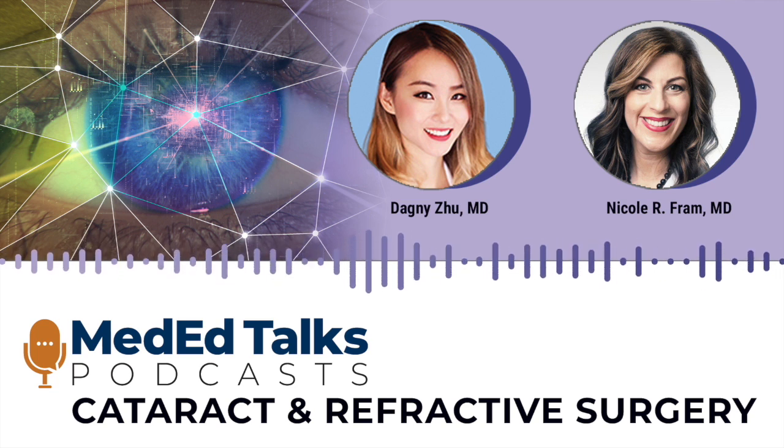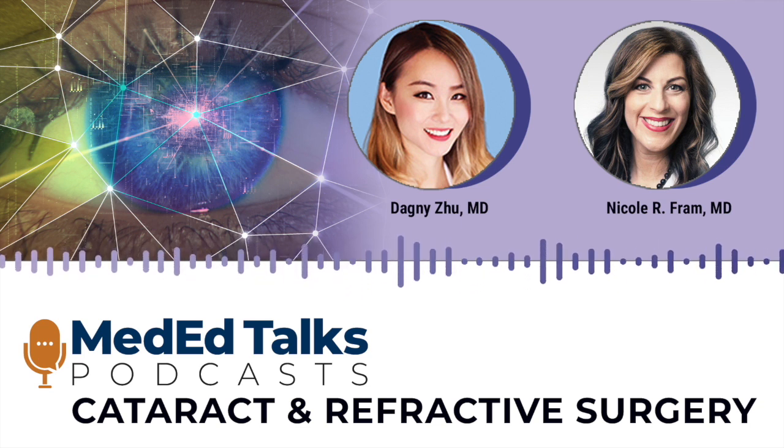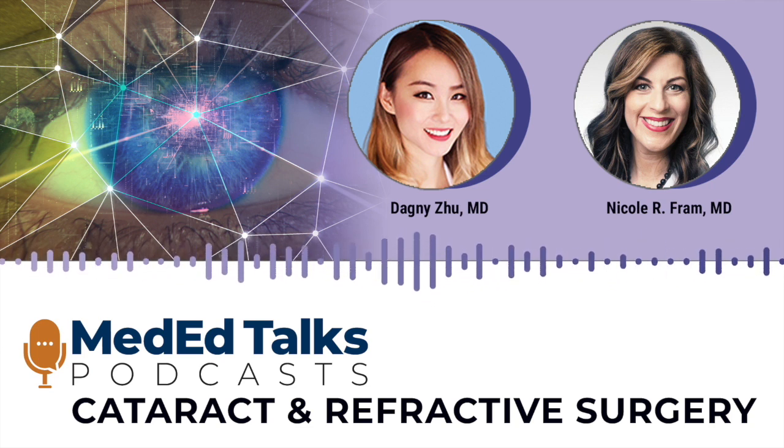No, definitely. I get that same feeling. And along the same lines, I feel like being able to identify a Descemet's detachment early on during cataract surgery is really helpful to have intraoperative OCT as well, so you're not further aggravating that and causing an issue.